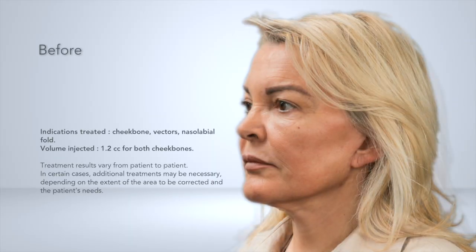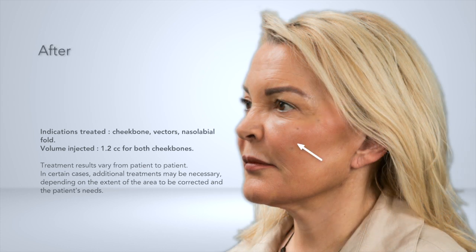The results obtained using the Radiesse injection are as follows during cheekbone restoration.